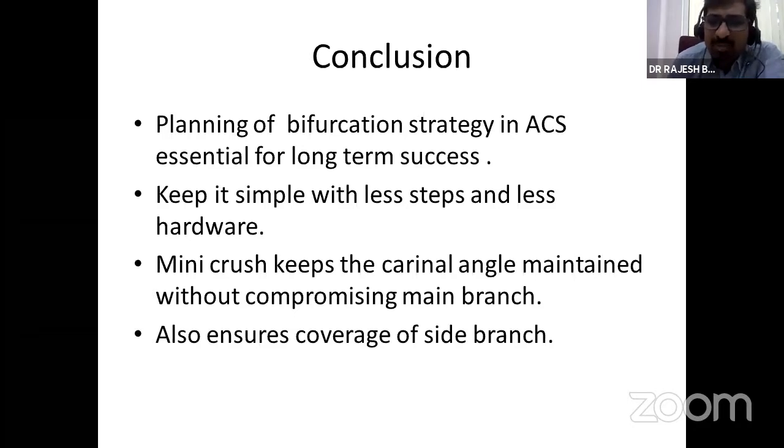And both the POTs are very, very important. The first POT after the stent deployment helps in the access of the wire, and the second POT ensures that you have really deployed your proximal stent in the main branch very well.